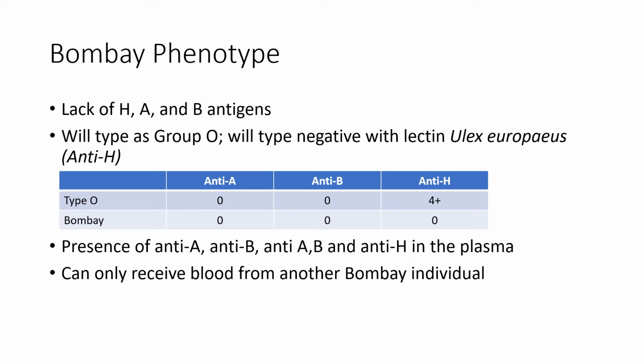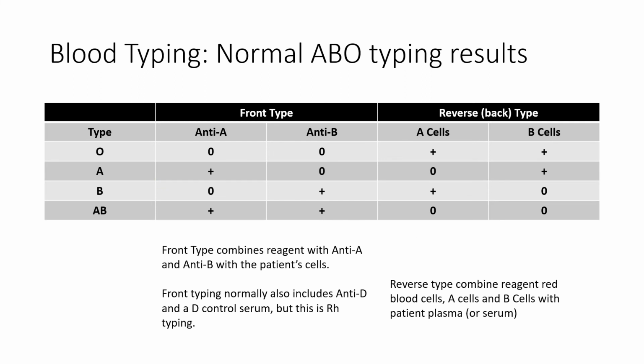The rare donor registry will have a list of suitable donors. There may be frozen blood that can be thawed for the patient. If a surgery is planned, autologous blood can be donated. These are what the normal ABO results should look like for each blood type. You should have this memorized and be able to know if there is a problem with the results.